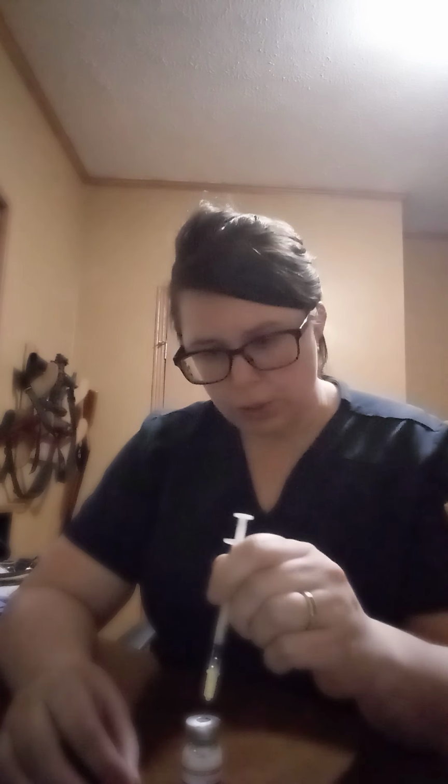Now this is helpful when you draw up medication in a different room from your patient and you have to walk with your syringe to the patient's room. So that keeps you safe. If you can avoid it, avoid recapping needles, especially if they have been used. You want to make sure you have a sharps container next to you. If you absolutely do not, then you can do the scoop method, recap your needle, and then walk it to the sharps container to dispose of.